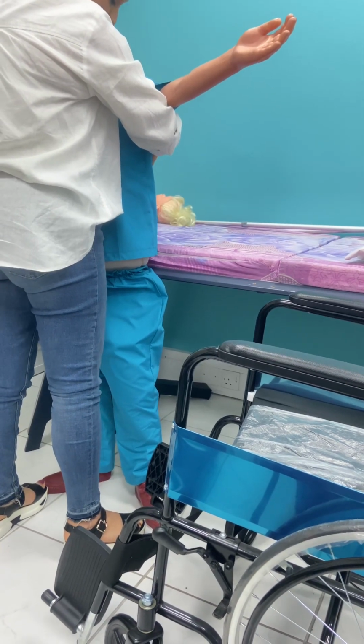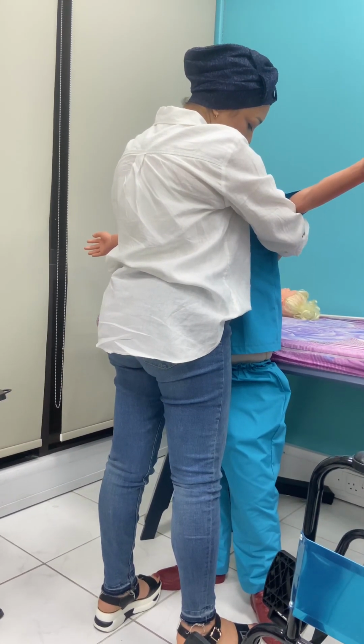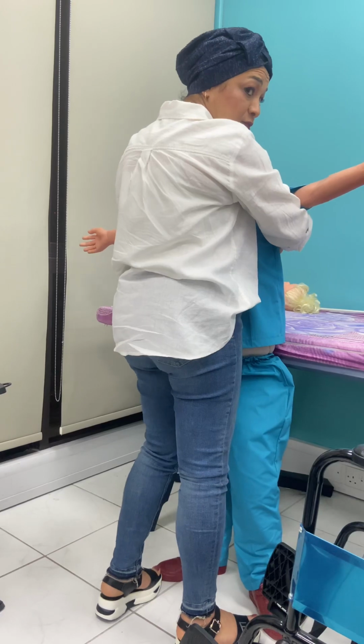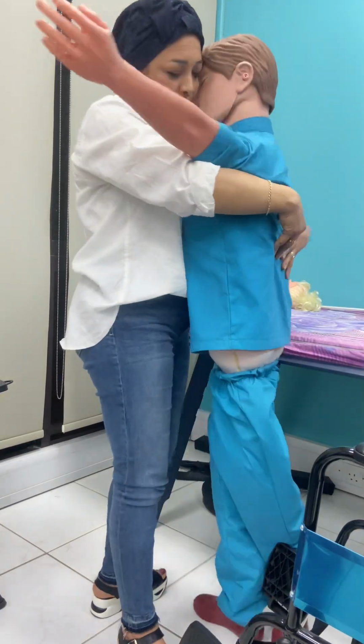Okay, so now third step, we are going to turn towards the chair. So when I count 3, you have to turn with me. My leg is always supporting his weak leg, so that he doesn't fall. Okay? So 1, 2, 3.